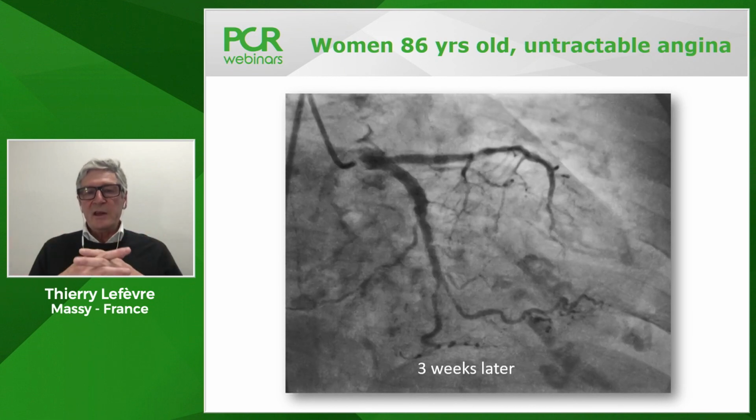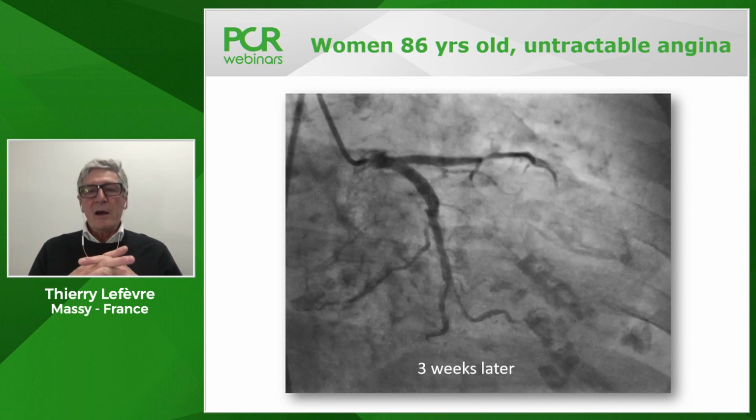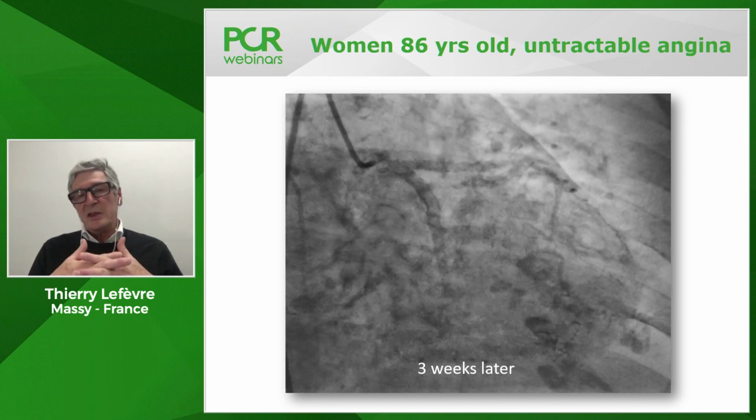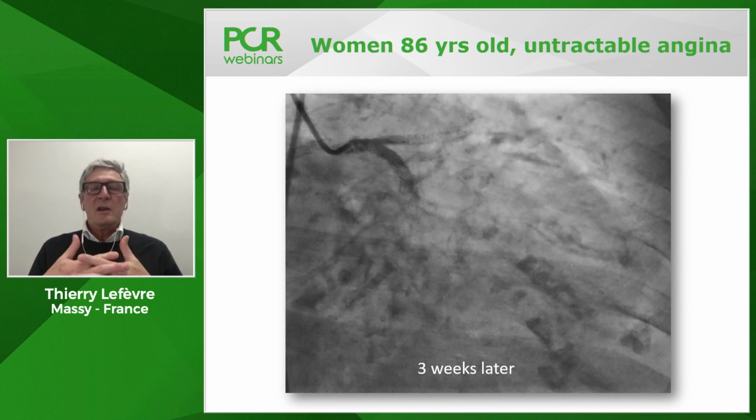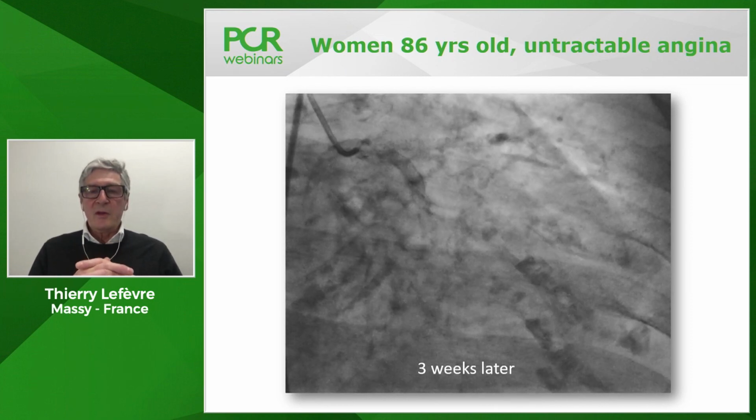And if you do that, I think at the end you will have a very good result, and you have no carina, no narrow carina, which I think is better for the patient. But of course, if you have any doubt, you can do a TAP technique.